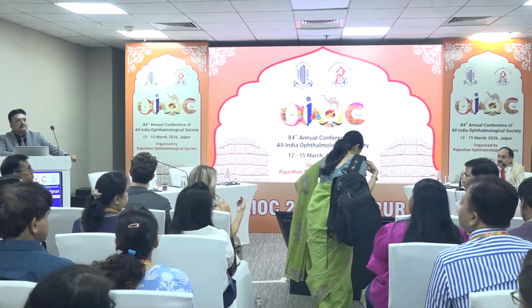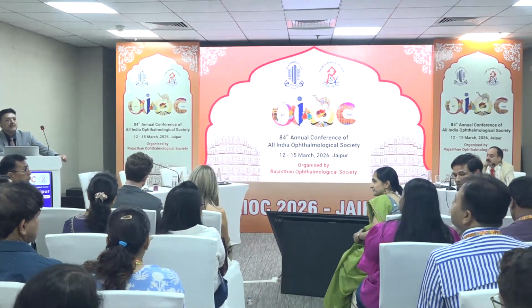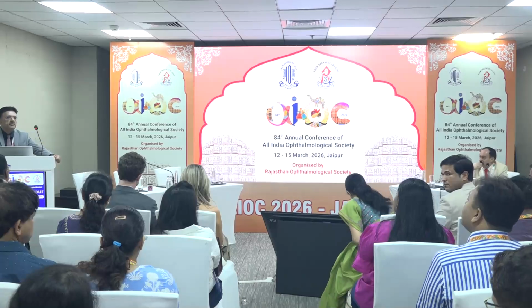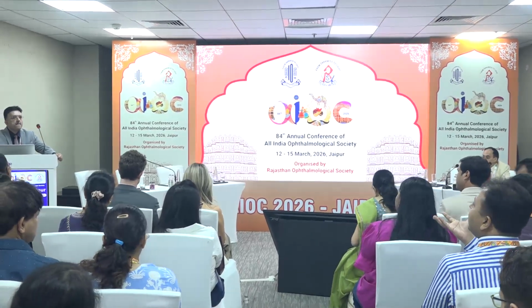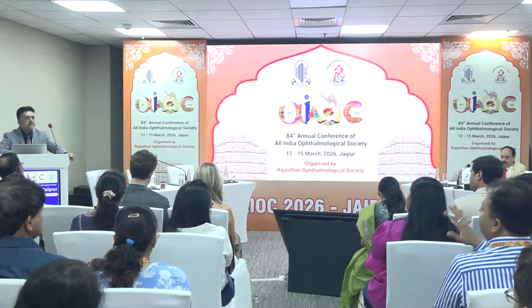So what is your thought about CTR in a high myope? Yeah. Because the layers become bigger, because the area inside is too big, so the lens may be affected.